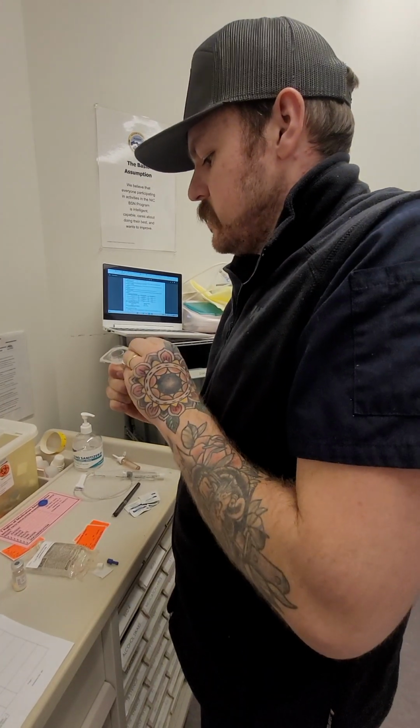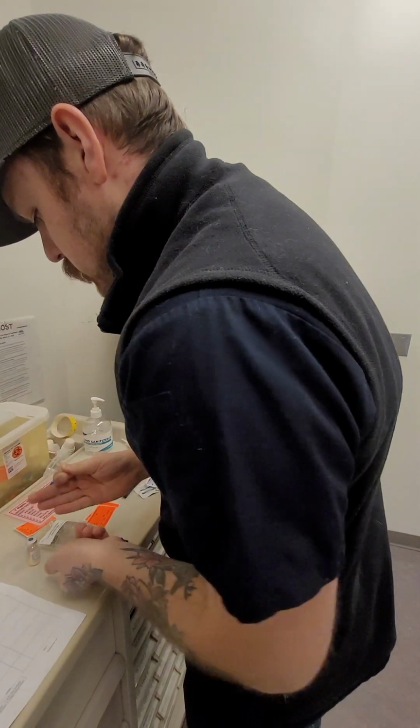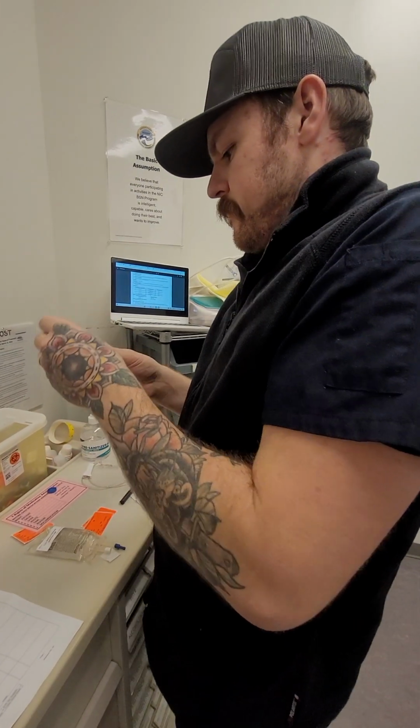Chew up all my time just doing this. Okay, so we've got that. We're not going to touch that. That's a sharp. This is dry for 15 to 30 seconds. We're going to go ahead and place that on there.